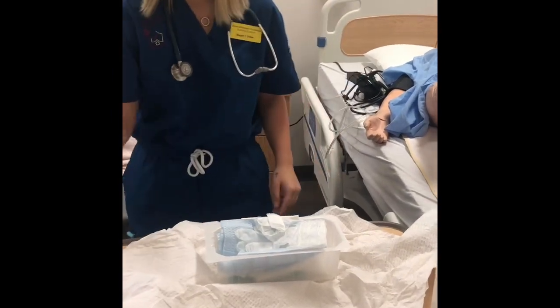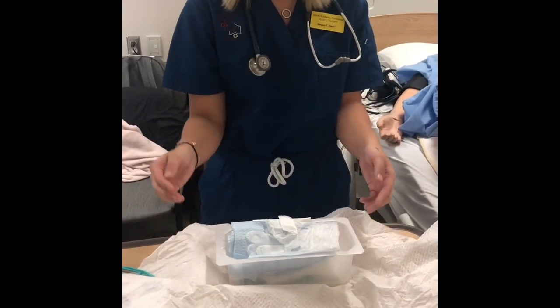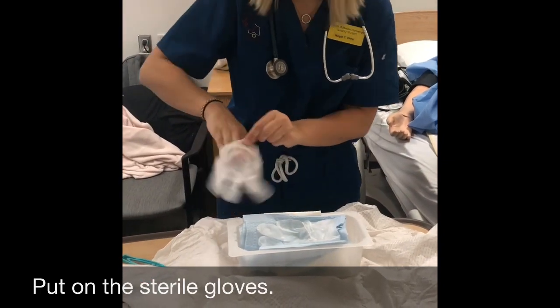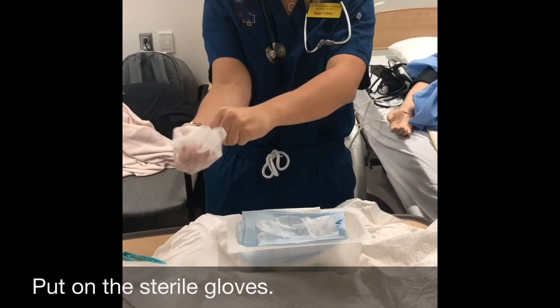Okay, and I'm gonna set my tweezers at the border of that. And I'm going to put on my sterile gloves. So I'm gonna be sure to not touch the inside or the outside of it.